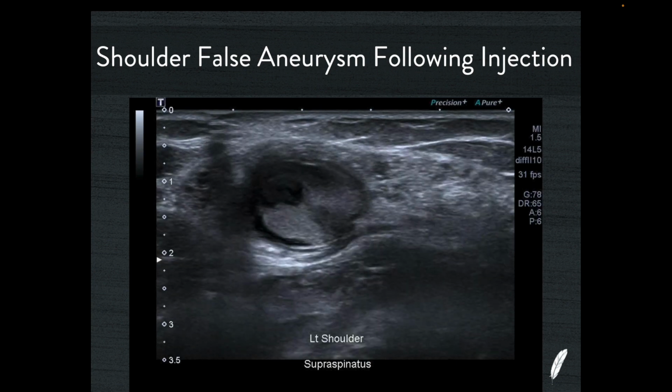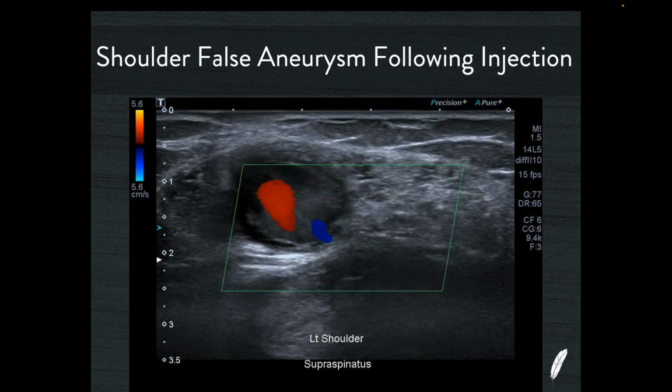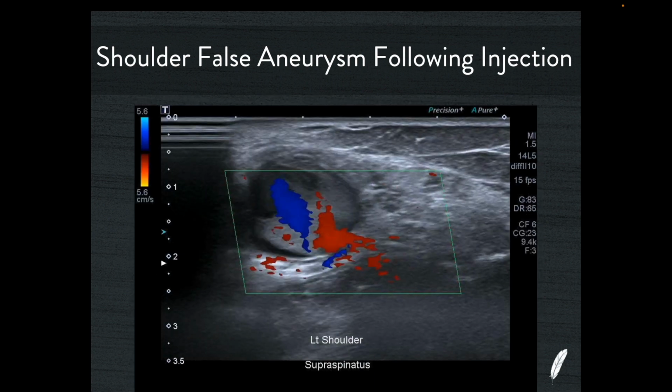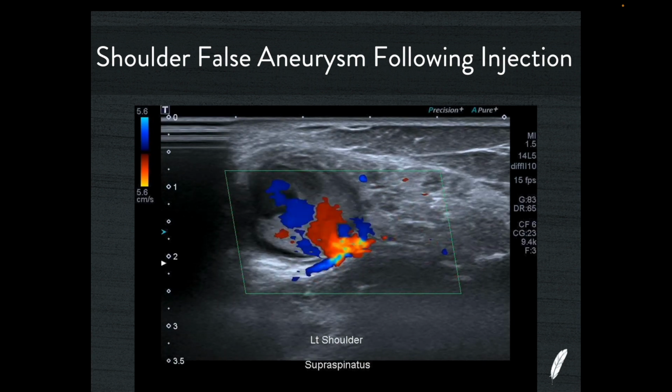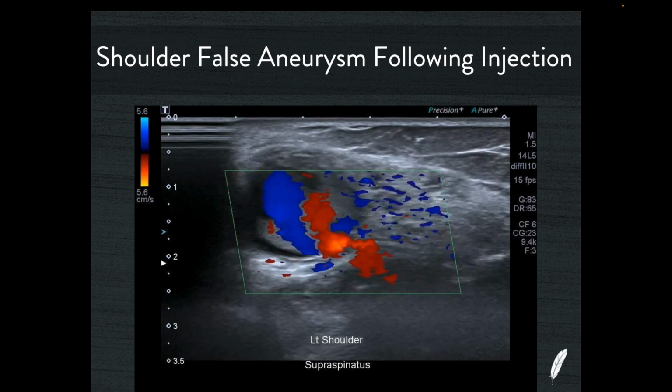It really just goes from the side wall of the vessel directly into this false aneurysm. But I love in the B mode here how you can see during systole the red blood cells puffing into the hematoma, and it's got genuine active flow in it, and this is a false aneurysm. You can see in this nice video how we've now lined up the length of that tiny vessel sitting underneath the deltoid, and you can see the little short neck, and the way that it's emptying the blood into the false aneurysm sac.